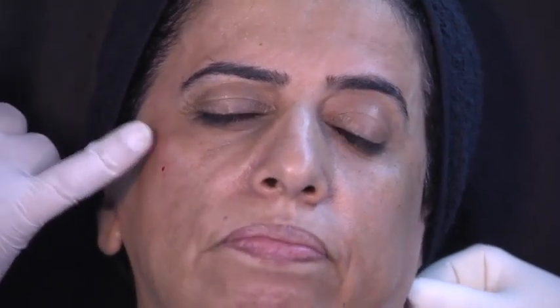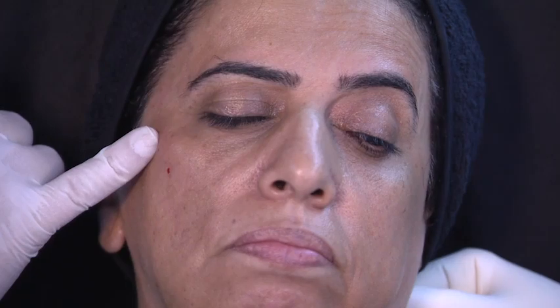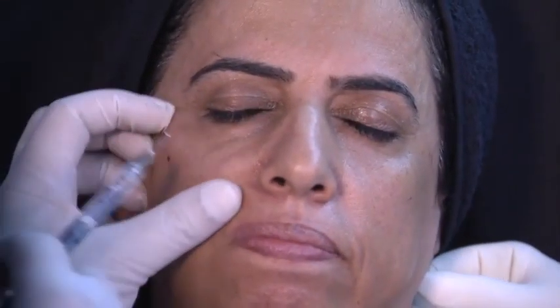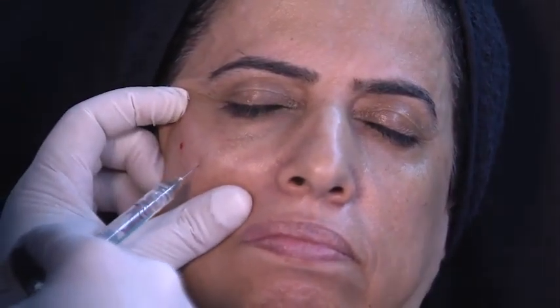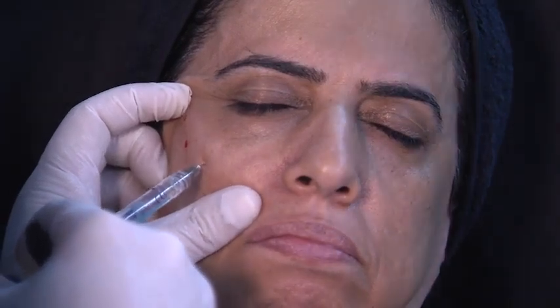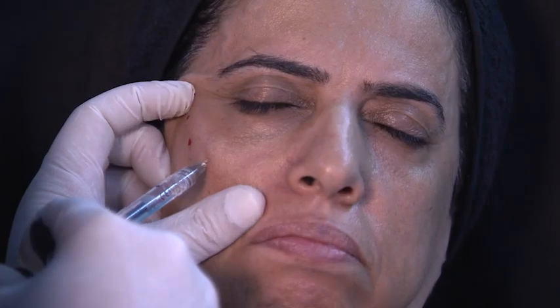Again, exaggerated nodule. Just to differentiate between this injection technique and the previous one, this is just bolus, not a pyramid technique. Remember that when I need projection and lifting, I prefer the bolus technique. The only difference is that here, I don't want an artificial high cheekbone because she has no volume at all. So I'm going to add another 2 extra points lower at the end, okay?